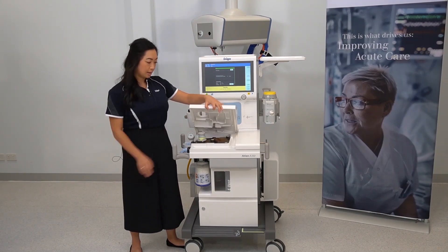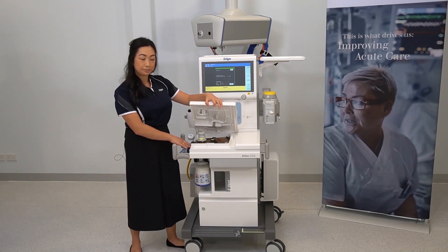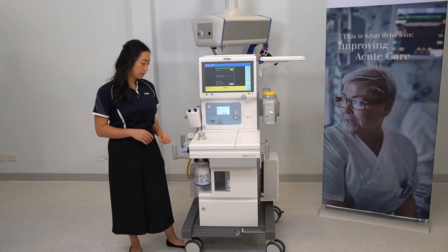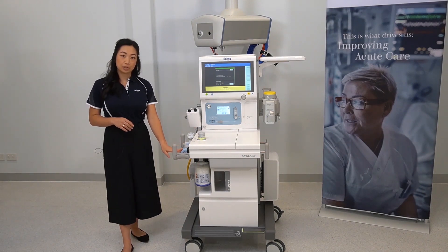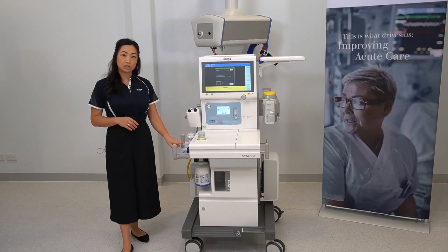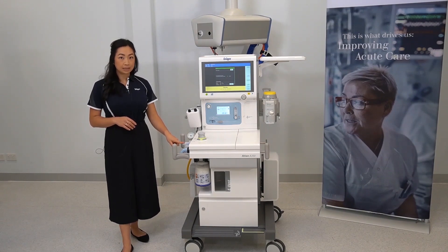Underneath this cover is the breathing system: the APL valve, the inspiratory and expiratory ports, and the port for your bag limb with the notch, which is utilized during the system and leak test.